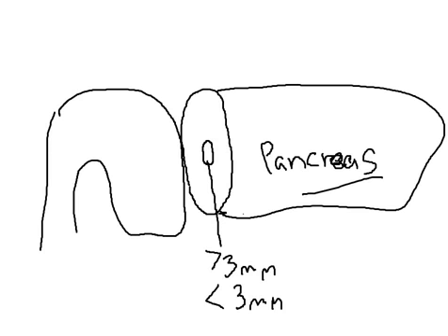So the first technique that I like to describe is the duct to mucosa technique. This is my preferred method of doing the pancreatic anastomosis in the majority of cases. When the gland is soft and the duct is under 3 millimeters, I will change to alternative techniques. And when there is more than one way of doing something, there's clearly a reason for that, and that's because there is no perfect way of doing it. So what's my preference may not be another surgeon's preference, and so forth.